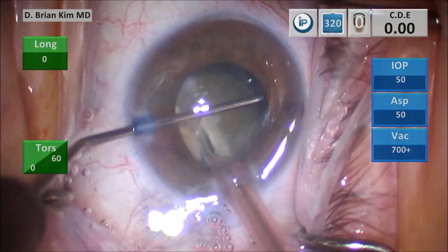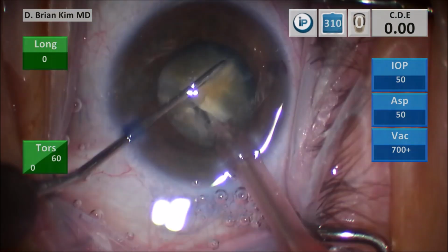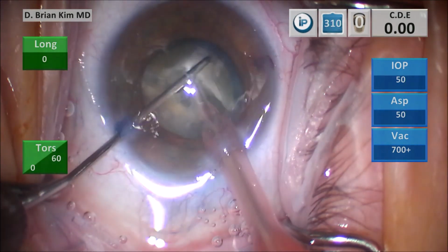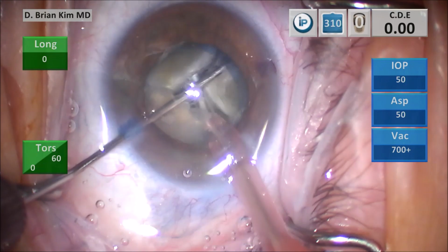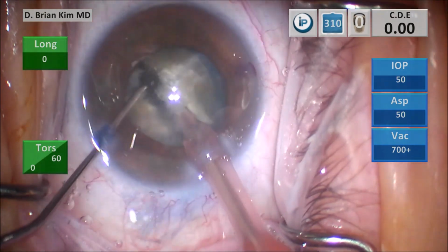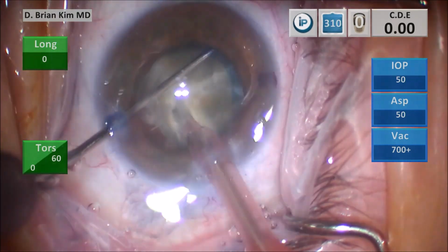Place the chopper around the right heminucleus, pulling it centrally towards the phaco tip. You can feel the thickness and the resistance of this very dense lens as I pull it towards the phaco tip. I'm able to divide it, and then you can see it's separating pretty nicely there, and that's the cross chop.